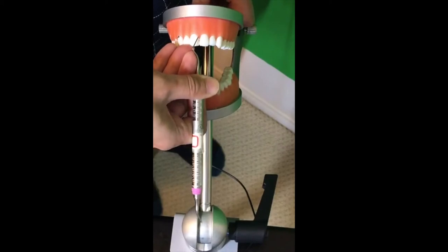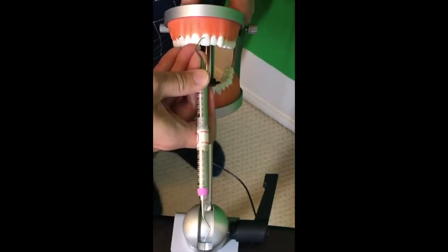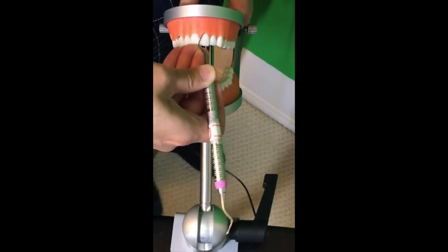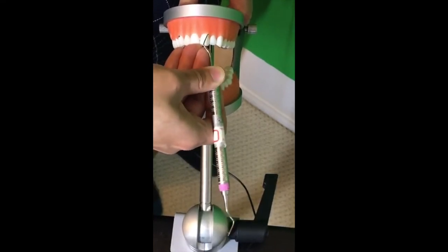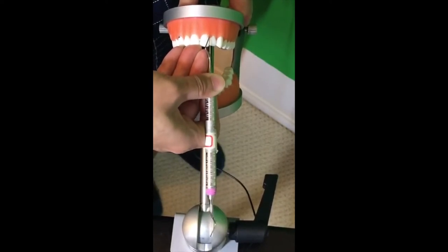See how much low lateral pressure I'm using — subgingivally. Go up and down, go around with the toe one-third, keeping the 70-degree angulation, then go up and down. All the way in — I'm only doing the surfaces away right now.